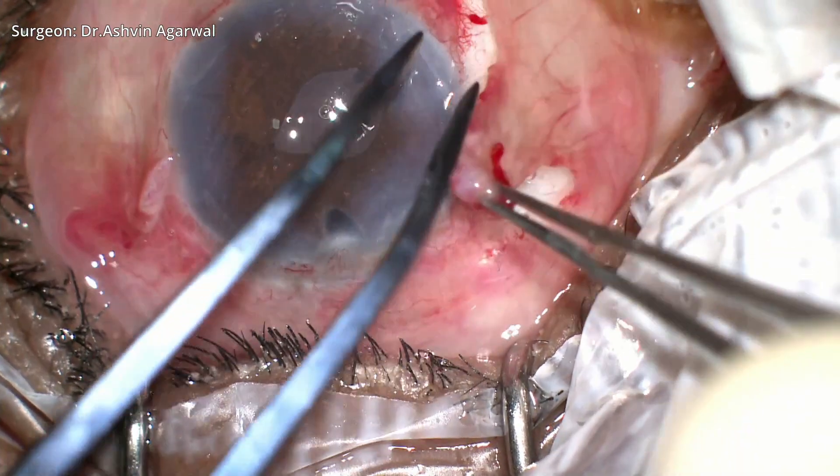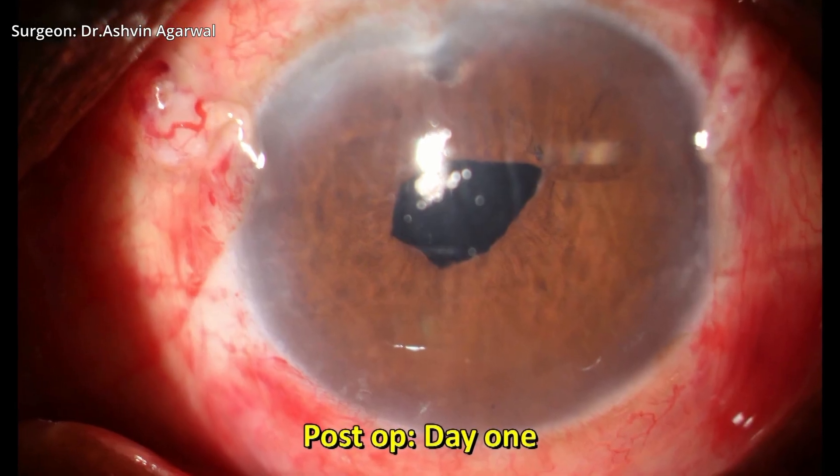Once the pupilloplasty is complete, fibrin glue is applied under the scleral flaps and the flaps are secured, followed by conjunctival closure over the flaps.